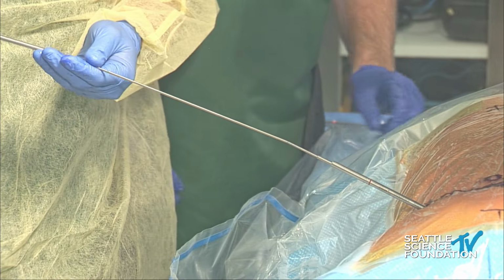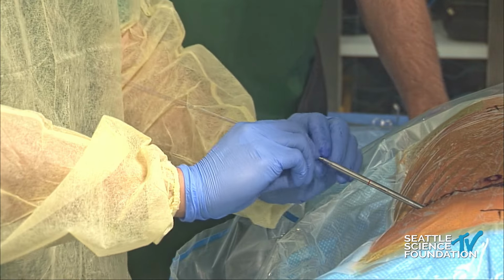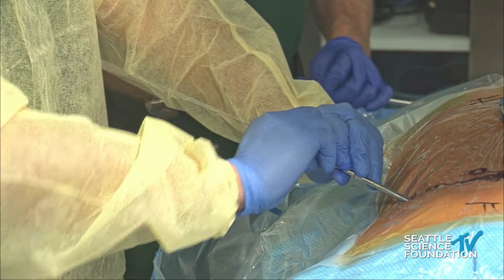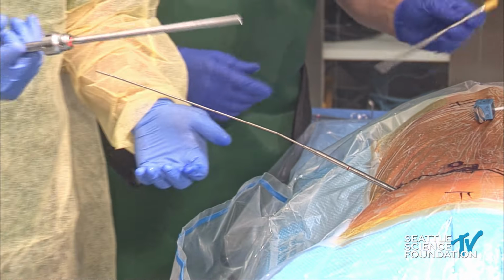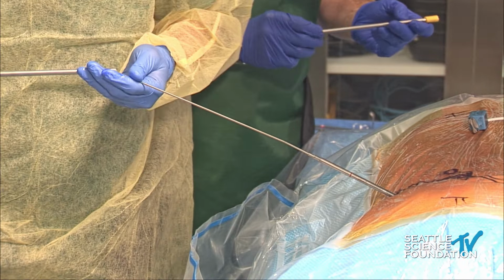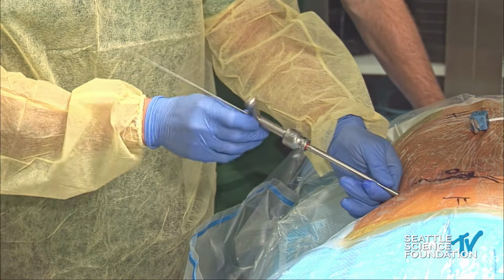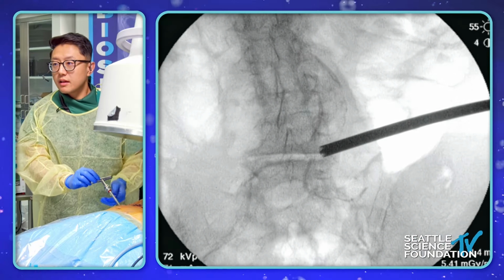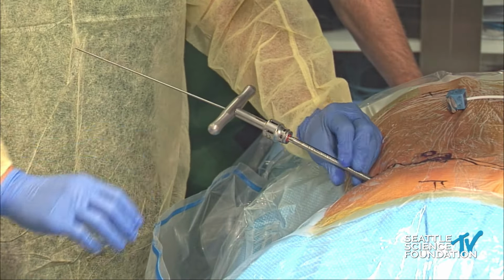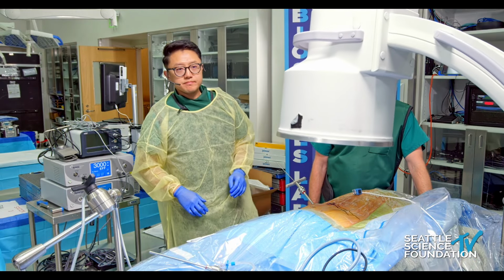Yep, no problem. That's actually a common thing that will happen, that one of the dilators will get bound up by bone in the reamer, and then it'll come out, and you just have to put it back in. Sometimes it actually drags your whole system out, including the guide wire, so you just have to retarget. There's not much of a way around that. See a shot there? Okay. Why don't we take a lateral just to get an idea of what we're looking like?